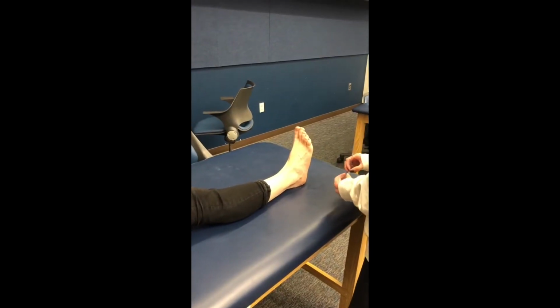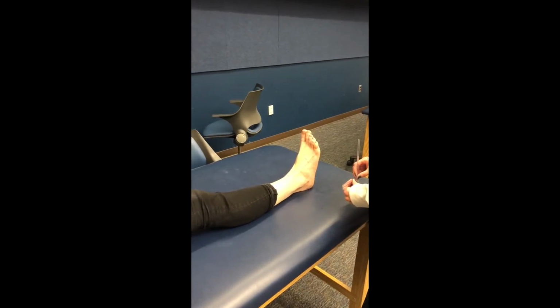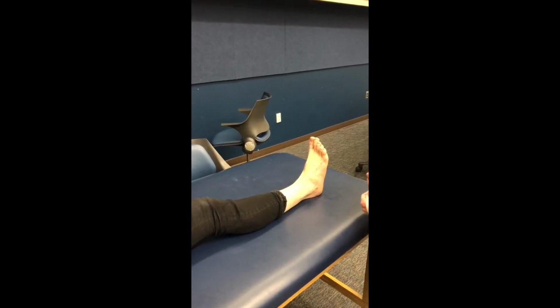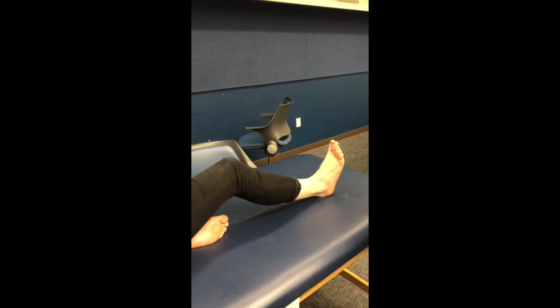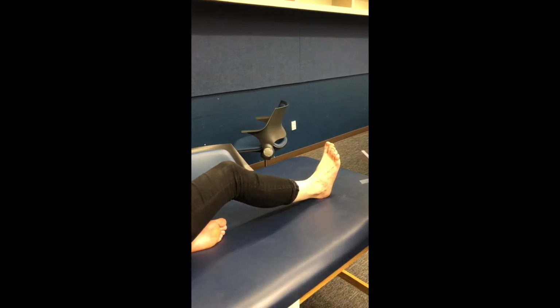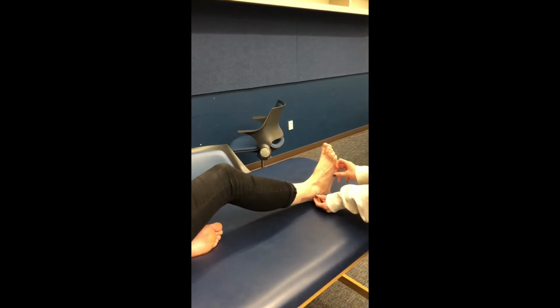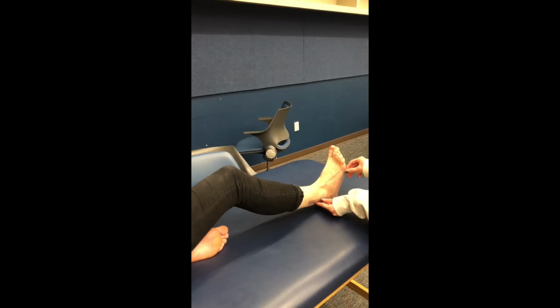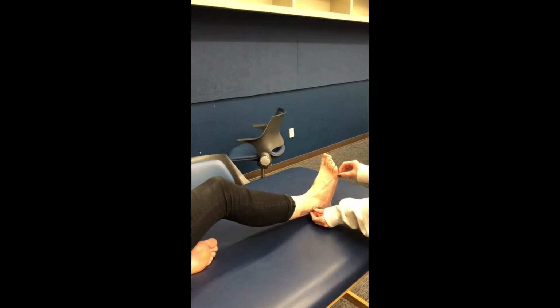Ankle goniometry, ankle dorsiflexion, 0 to 15 degrees. Position of the client, supine or seated with knee flexed at least 30 degrees, ankle at 90-degree neutral position, and foot in 0-degree inversion and eversion. Position of the goniometer, axis below the medial malleolus, stationary bar parallel to the longitudinal axis of the tibia, movable bar parallel to the first metatarsal. Client will dorsiflex the foot.